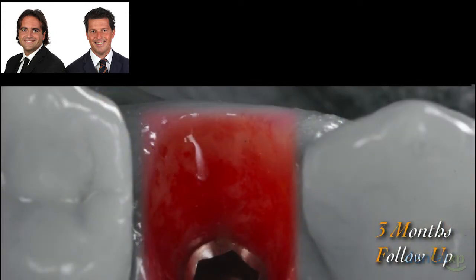So, as you can see, what Alessandro showed to you, right now we are at the 3-month follow-up, and this is exactly the picture that you want to see when we first unscrew the provisional restoration in this kind of patient. We want to see a thick, robust tissue that will help to mimic our final rehabilitation and all the prosthetic components underneath, and we want to have also a good vertical component, because we need to give to our technician the possibility to develop the correct emergence profile of our final crown.